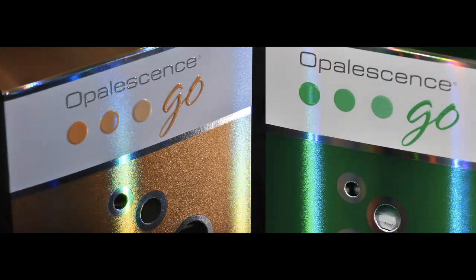Now, this is a different product. This is Opalescence Go, and this is by Ultradent as well. This product is a tray-free bleaching product. This is hydrogen peroxide, I would say lower concentration. They come either in 10% hydrogen peroxide or in 15% hydrogen peroxide. So this is not 35% hydrogen peroxide like you would use in the office.